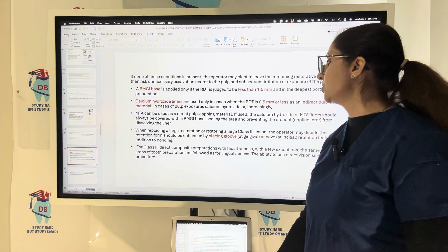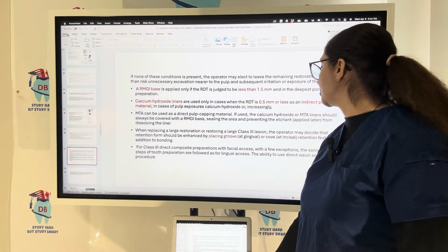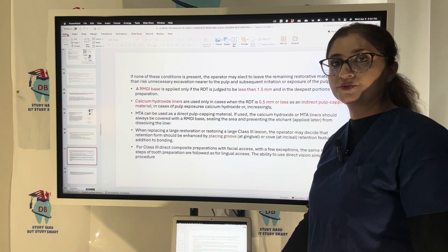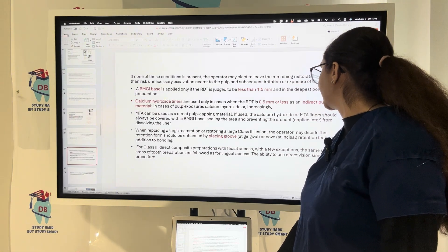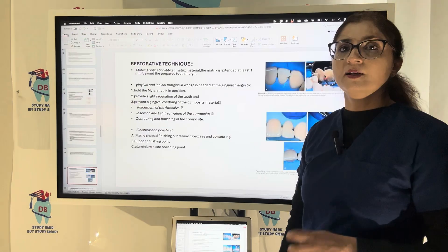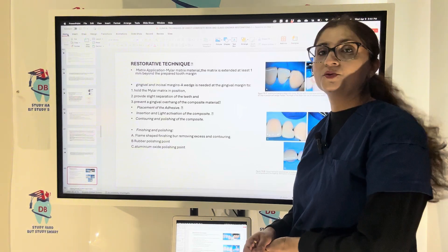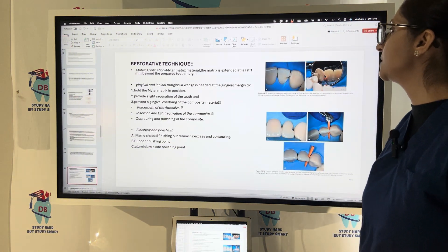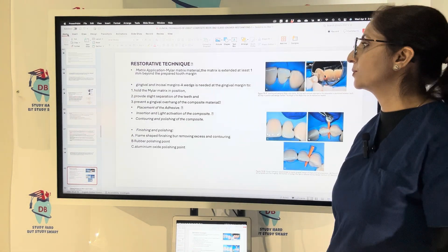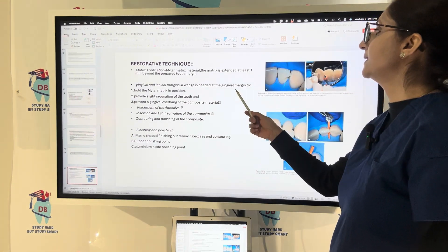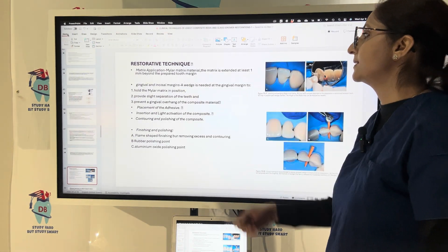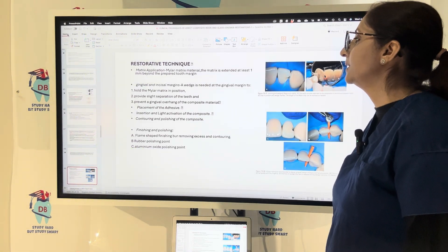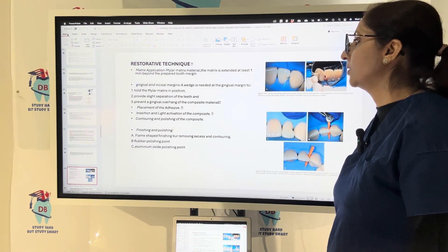When replacing a large restoration or restoring a large Class 3 lesion, the operator may decide that retention form should be enhanced by placing grooves at the gingival area or a cove at the incisal retention feature. For the restorative technique, a mylar matrix material is used — a transparent strip extending at least one millimeter beyond the prepared tooth margin. A wedge is needed at the gingival margin to hold the mylar matrix in position, provide slight separation of the teeth, and prevent gingival overhang of the composite.